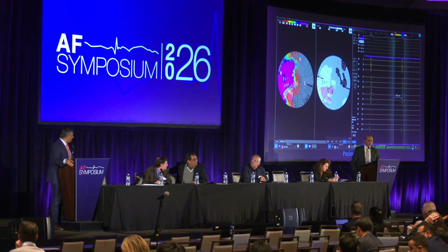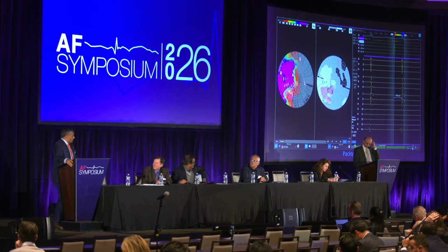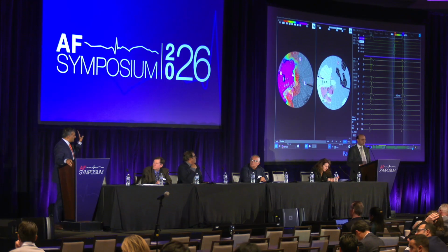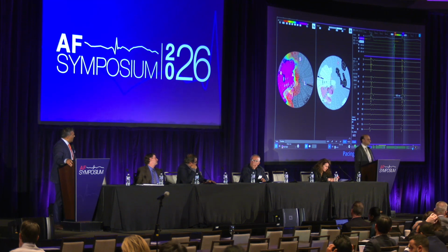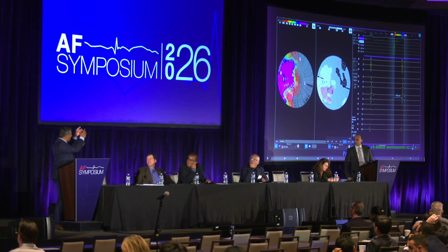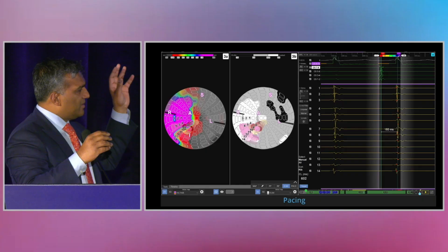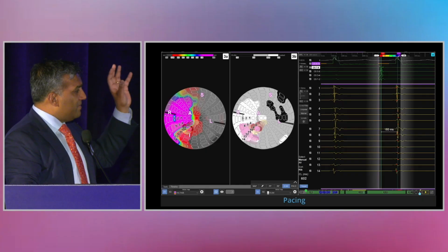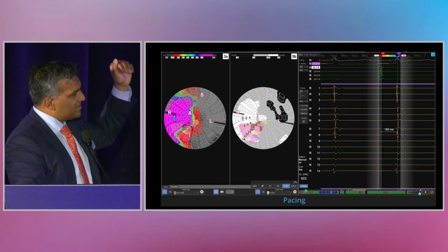What about the SVC? Good question. We have put it there. I have not ablated there. But you could, because you can see where the sinus node is, right? You can't change the size of the balloon, right? It depends. To be clear, you can't put it in the SVC, but you can push it up to the roof where the SVC is. That we've done. You could map in sinus, identify where the sinus node is, and just select electrodes away from it, so you don't hit the sinus.